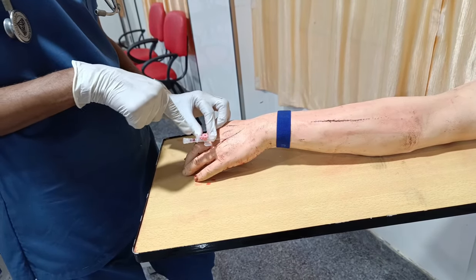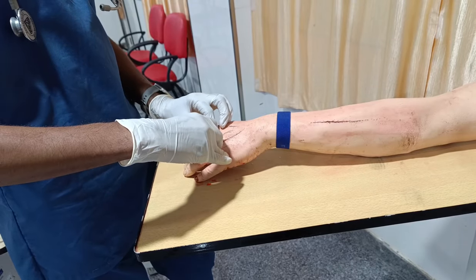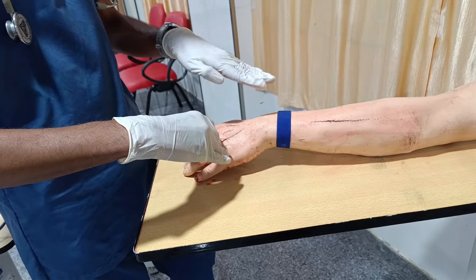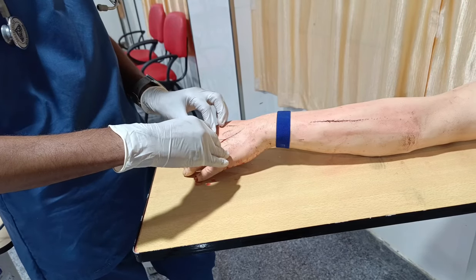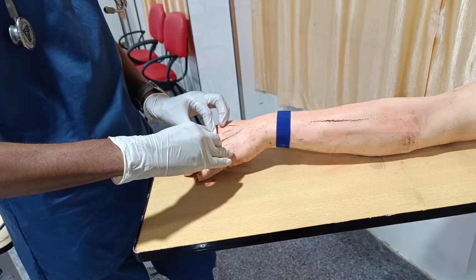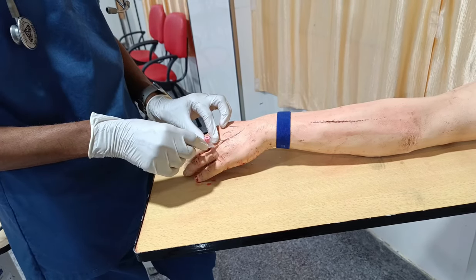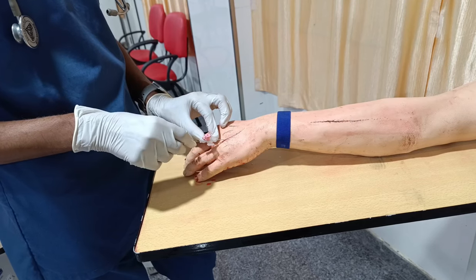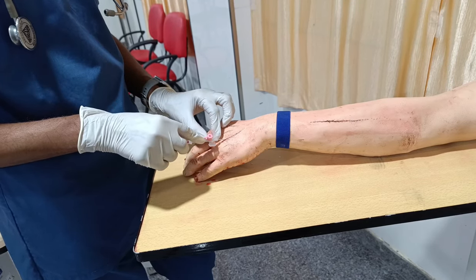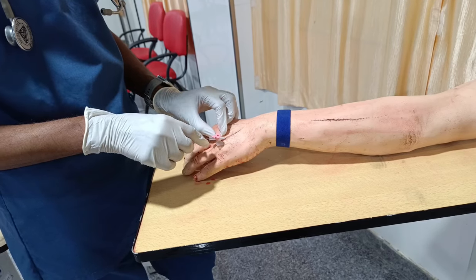After seeing the flashback, you reduce your angle from 30 degrees to 10 to 15 degrees and slowly introduce your catheter. Partly withdraw the needle, and I will tell the reason later. Then introduce the plastic portion alone, right up to the hub.